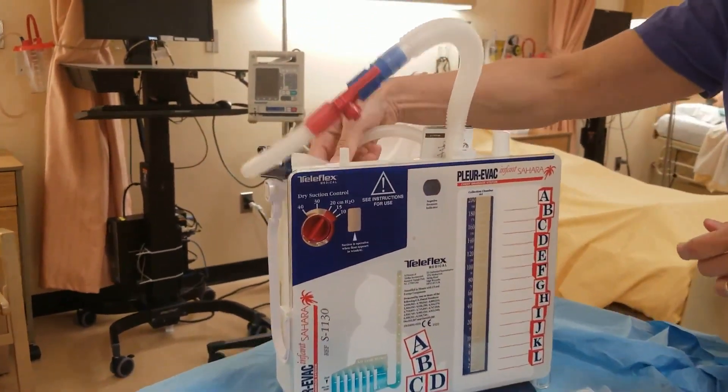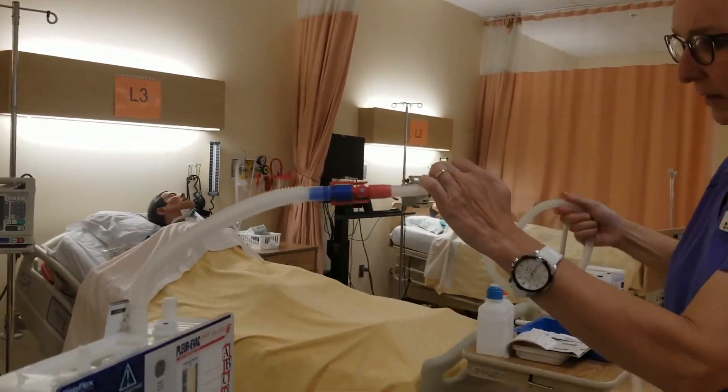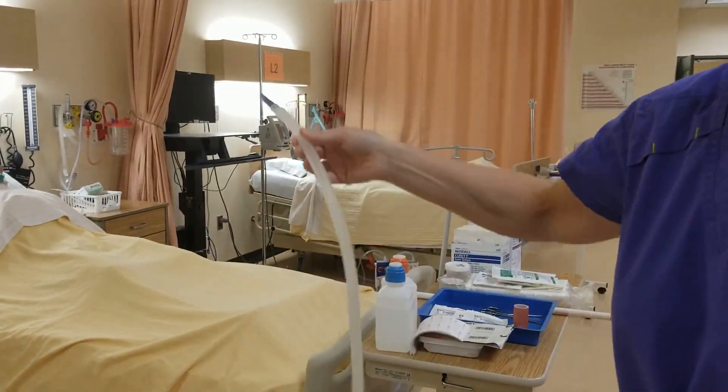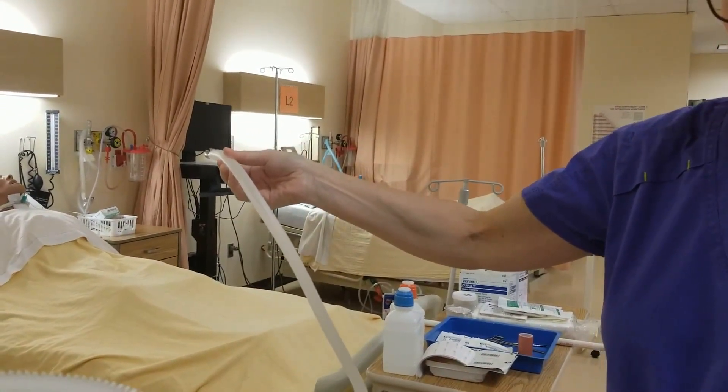The other thing you will find is that there is this tubing, and this is the tubing that will connect into your patient. So this will be attached already, or you will hand this off to the physician when they are inserting the chest tube.